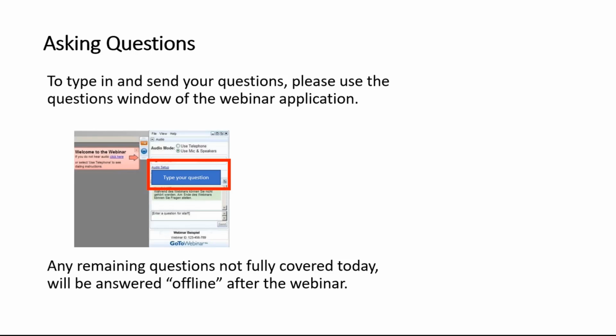Yeah, that's a very, very interesting question, because now we are really working on automatization of such an approach, first of all for CSCR, and we believe that machine learning technologies can facilitate such planning, specifically for specialists who are maybe not so experienced in detection of leakage points or microaneurysms with en face OCT.